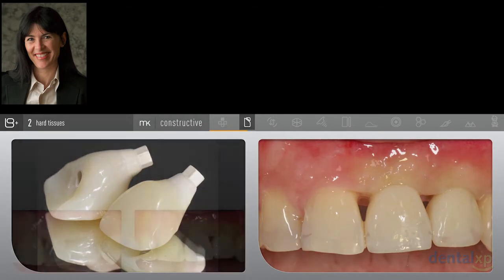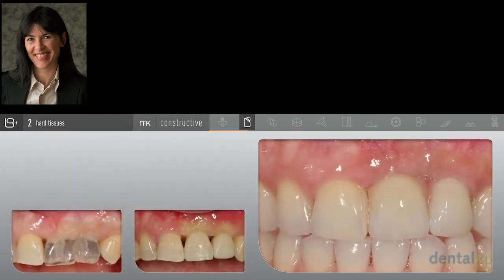And in reality, what we have to do is, from a surgical standpoint, we have to accept that there are still limitations to what we can do with soft tissues. And a lot of the time, I would tell you, I still have to rely on what my restoring colleague can do from the aesthetic perspective in masking the deficiencies that I've not been able to recapture.